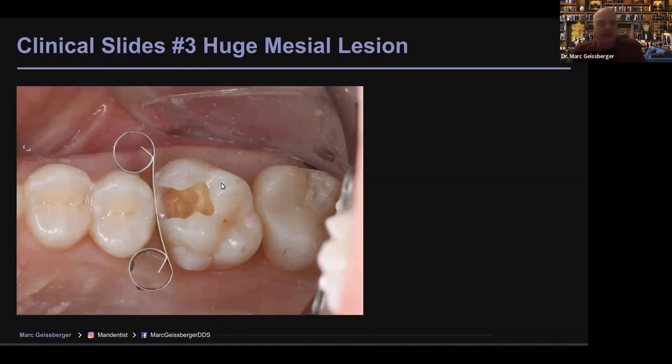Now, here's the benefit of the Interguard. Number one is that this Interguard acts as a separation or a pre-wedge. So it pushes the teeth apart. Not only that, it protects this premolar from me damaging it. But this restoration is really deep caries. And in fact, the pulp is living right here on this young individual. So this one got larger than I wanted, but I'm going to go ahead and place my sectional matrix band.